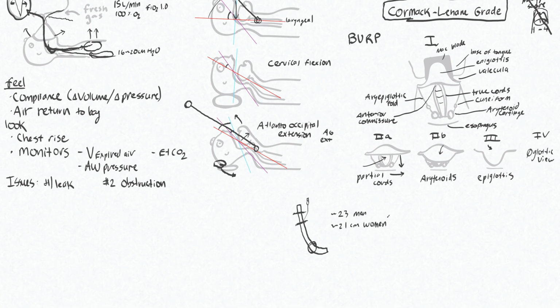Just be reasonable about the tube depth, and you will have to listen to the patient's chest to confirm that you have not inadvertently done a right mainstem intubation, so just for equal air entry on the left and the right hand side. And then you'll also get end tidal CO2 tracing to confirm. Now you're ready to tape the tube in place. And you're done. Now you just have to worry about getting anesthetic gas on board and starting your ventilator and doing everything else that we do.